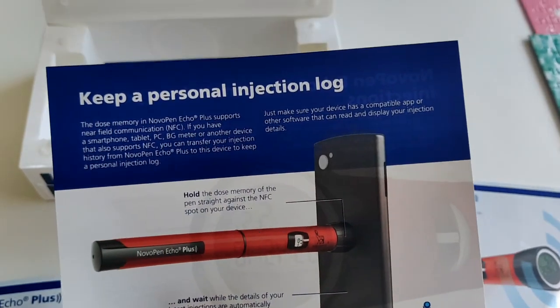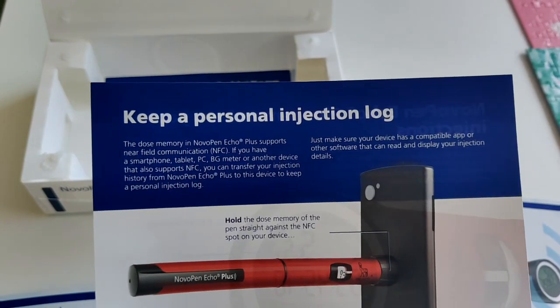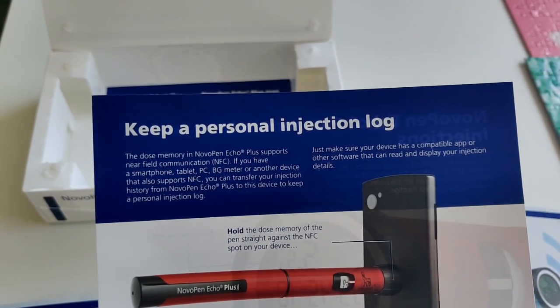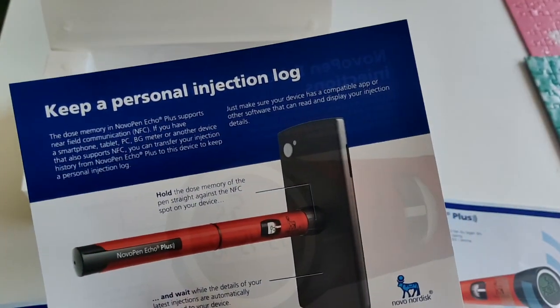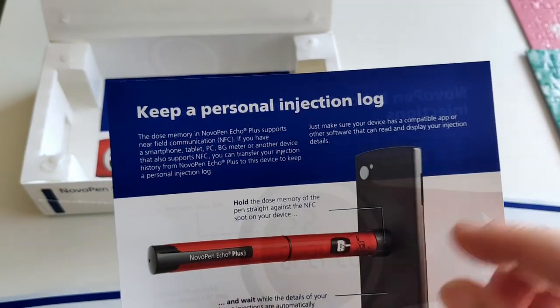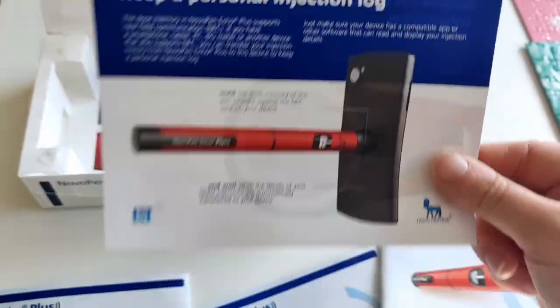Here's the smart pen feature: the dose memory in the Novo Pen Echo supports NFC. If your phone also supports NFC, you can transfer your injection history from the Novo Pen Echo to your device and keep a personal injection log — that is revolutionary. Make sure your device is compatible and that you have a compatible app; apparently you just hold the phone on and the details transfer. I'm wearing a Libre today and I know it works with the LibreLink app. We'll find out in this video what apps it works with.